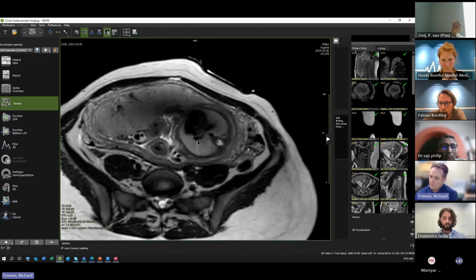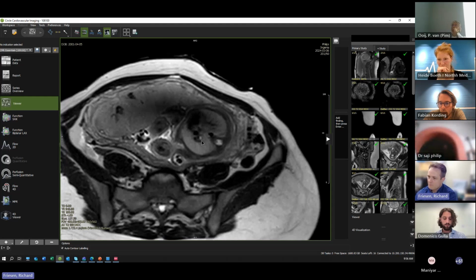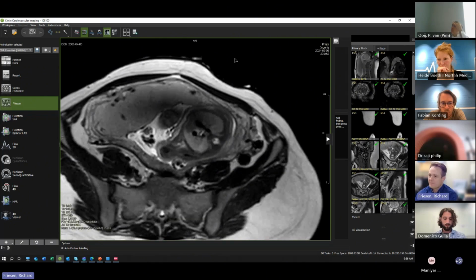And we'll see this a little bit more later, but in the region where we would expect pulmonary veins, we see these pretty dilated and engorged venous structures, which we're anticipating based on the fetal echocardiogram. And then coming upwards, we see more of these blood vessels that are in a little bit of an unusual location lateral to, to the right of, the superior vena cava.